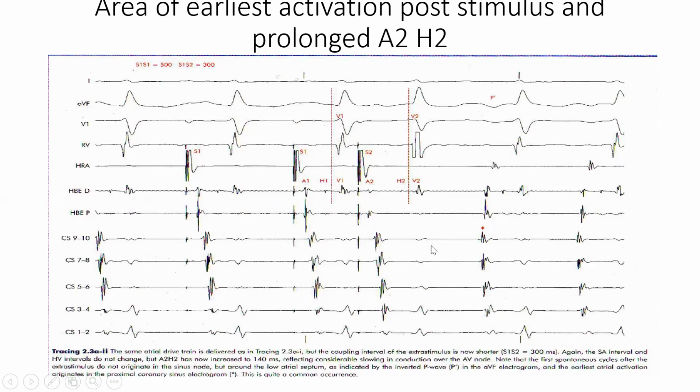What abnormality can you tease out from here? So I'll focus on it for you, the AHV. Between the first pacing at 500 milliseconds and when they shortened it to 300 milliseconds, what did you notice? I'm trying to circle around it.